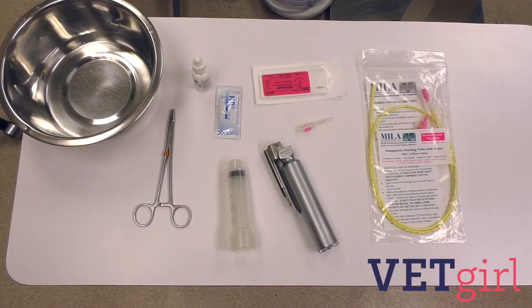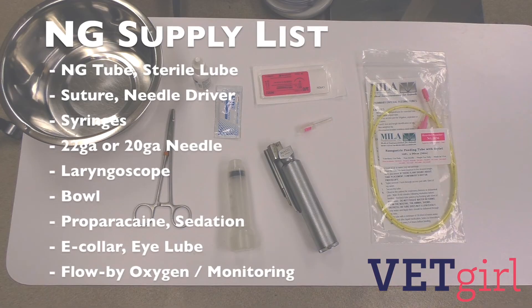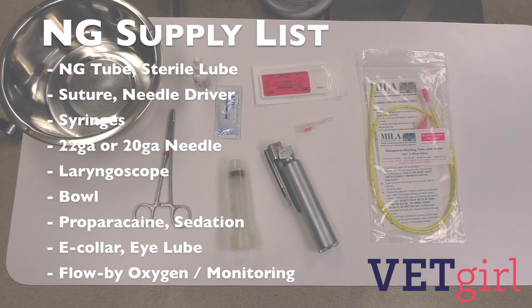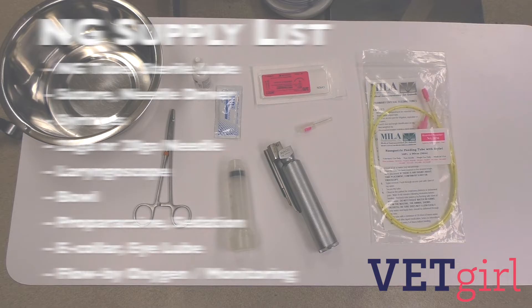To place an NG tube, first ensure that you are well prepared and have all your supplies ready. This includes an appropriately sized feeding tube, suture, syringes, a 22 or 20 gauge needle, a laryngoscope, a bowl, a needle driver, proparacaine, an e-collar, sterile lubrication, sedation, eye lubrication, and potentially flow-by oxygen and monitoring devices.